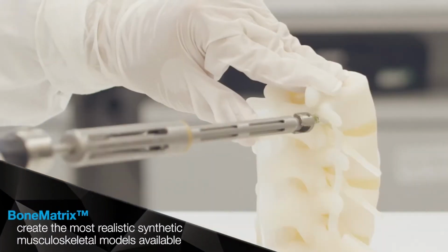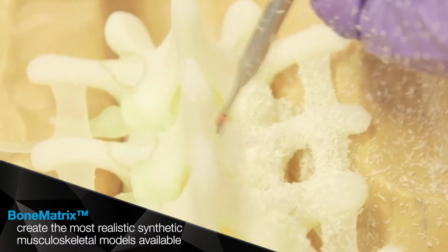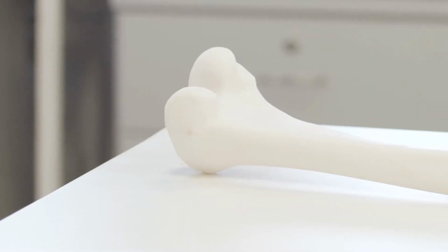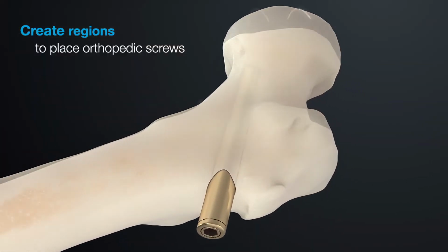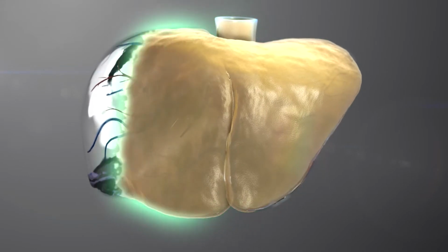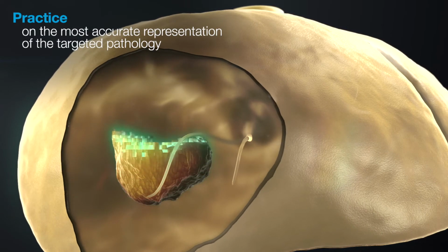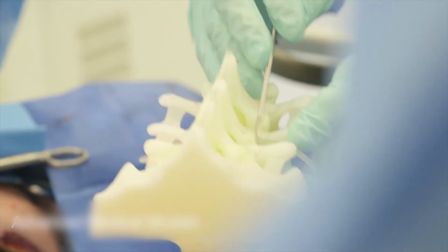Experience the density properties of human bone, mimic porous bone structures, fibrotic tissues, and ligaments. Models behave like native bone when force is applied, such as discectomy, drilling, reaming, sawing, and pedicle screw insertion. Even tumors and infected tissues can be added to your bone or organ models in their accurate form, so healthcare professionals can experience the same tactile feedback when performing medical procedures with surgical instruments and devices.